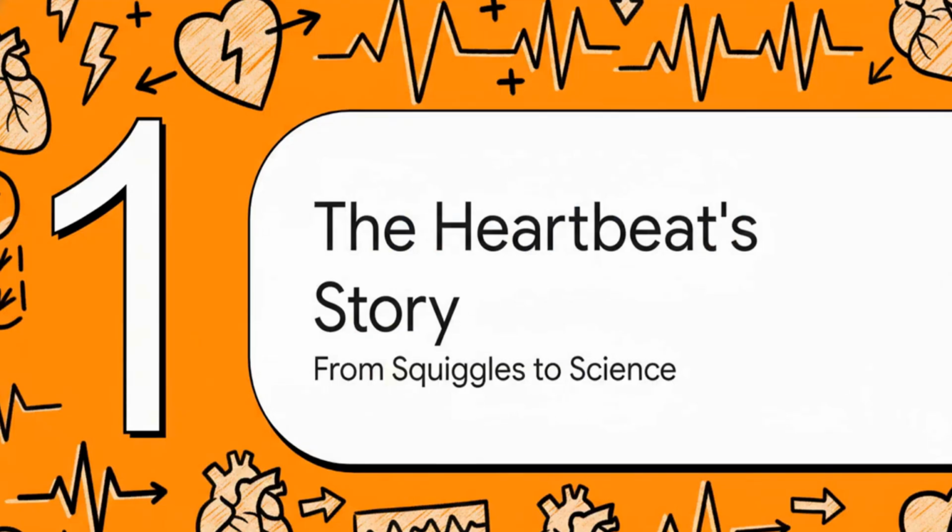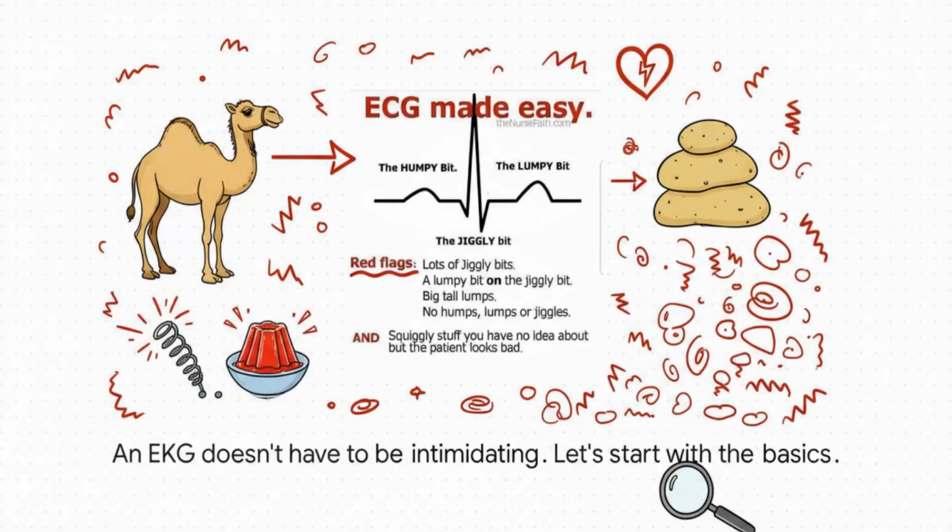All right, so to really get the QT interval, we first have to understand the EKG itself. I know, it can look like a bunch of random, crazy squiggles on a piece of paper, but it's not. It's actually a story. And right now, we're going to learn how to read it. Okay, I love this slide. It breaks it down into the humpy bit, the jiggly bit, and the lumpy bit. And you know what? It's hilarious, but it's not wrong. It really gets to the core idea here. Every single part of this waveform, every little bump and wiggle, is telling a specific part of the heart's story.